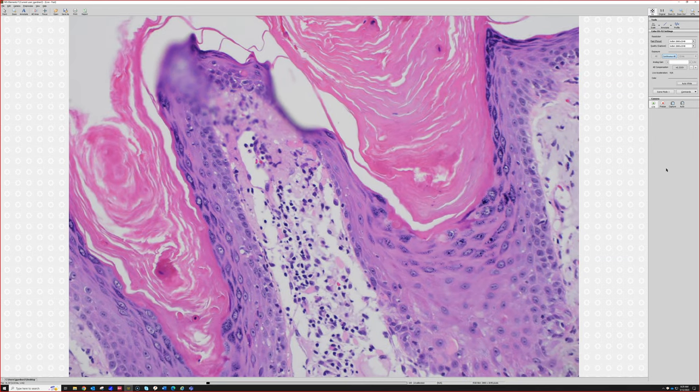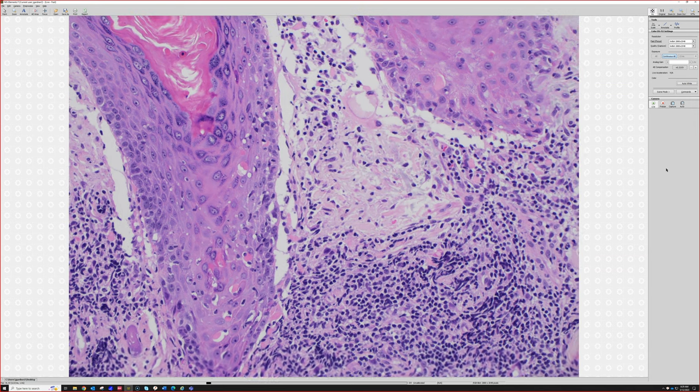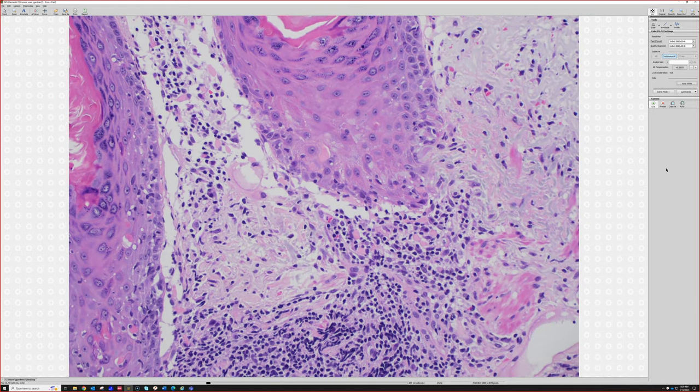To me, that's a sign that we've got some kind of burned out interface where the keratinocytes have died. The basal layer is getting disrupted. You can see it even better down here, extending down the hair follicle epithelium. And I find that pretty helpful. When you've got interface in the epidermis and going down a follicle, definitely start thinking about lupus. Sometimes other things can show that.